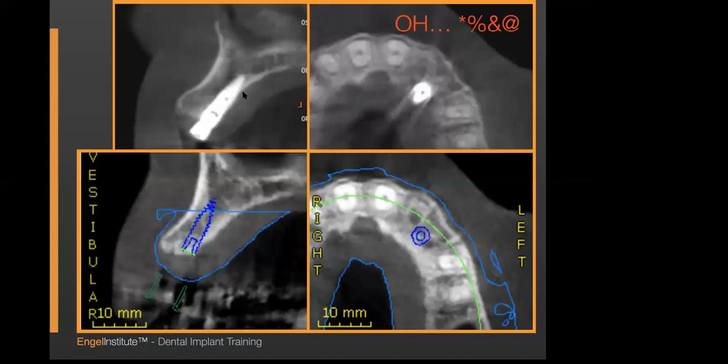Now, the one thing I wanted to tell you is the guide fit like OJ's glove. I mean, it fit perfect. So let's rule this out. If a guide fits perfect, especially a tooth-borne guide with all these teeth, what should you be thinking was good? You should be thinking that either your scan or your impression was good, because your scan is just like a night guard. If your night guard doesn't rock, you gave someone a good impression to make a night guard. So my impression was good.